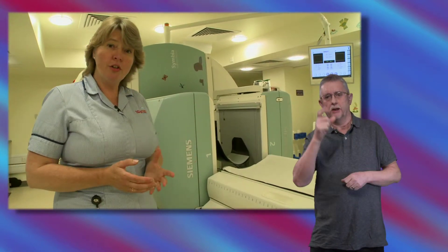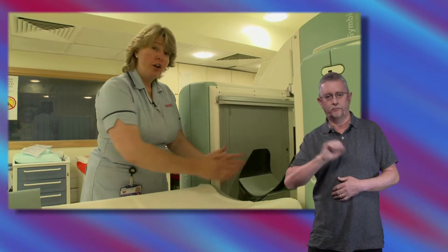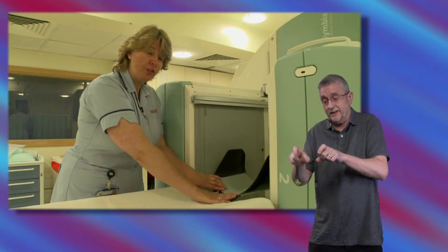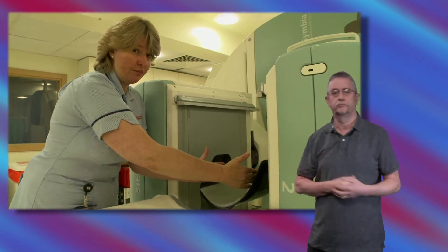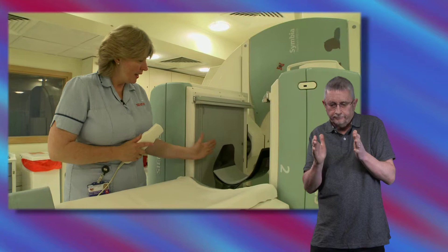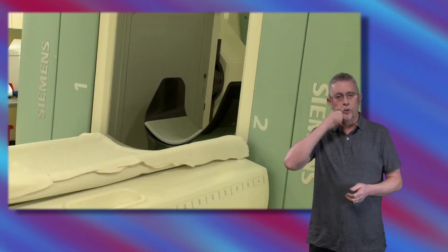When you come into the room, we will get you up onto the table and make you nice and comfortable. Your head is going to be here in our special head rest and to help you keep nice and still and be very comfortable for the whole of your scan, we're going to put two specialty cushions either side. When we've got you nice and comfortable, we will start to bring the cameras much closer to your head so that they're here next to the head rest and then we'll start to get them to move around your head.